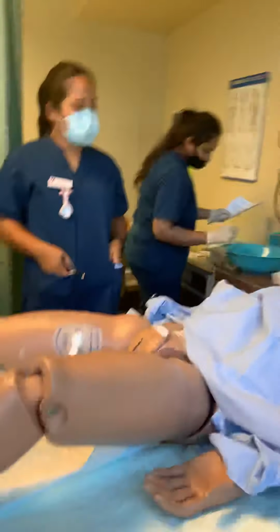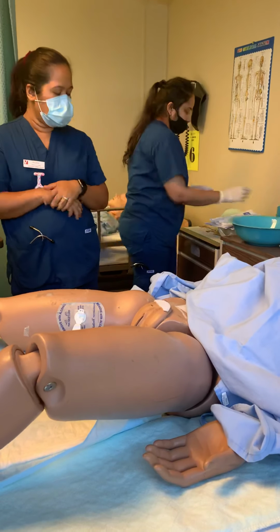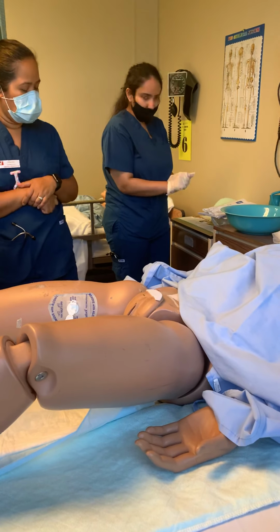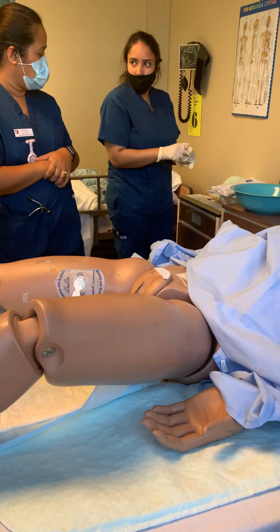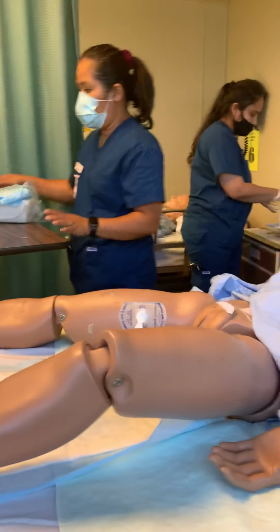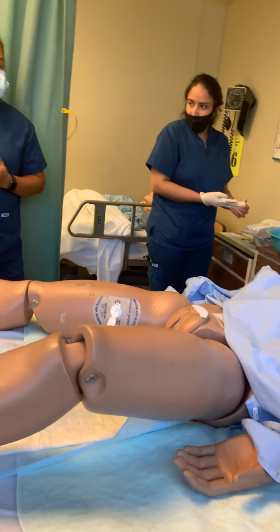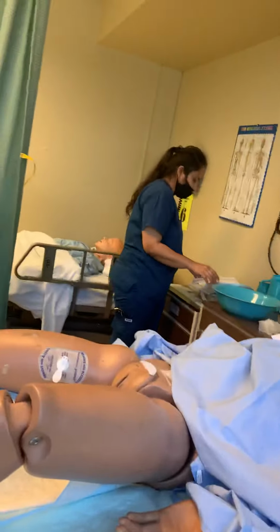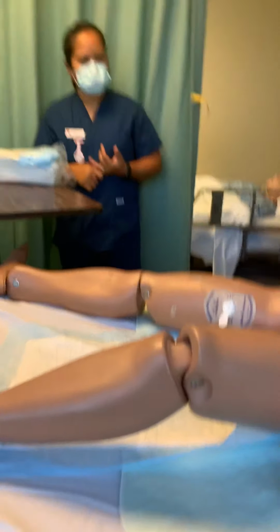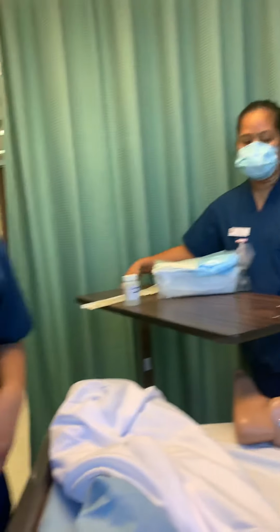And I find out that Mr. David, I need to do a catheter for him because he just had an appendectomy. Appendectomy surgery, right? So I wash my hands and check the patient's allergies, if they're allergic to iodine or shellfish, because I have to do a catheter on him. Check for any medical history and medication allergy.